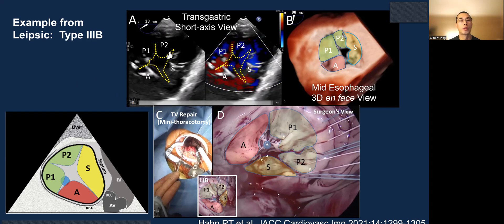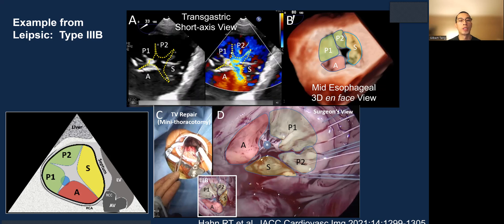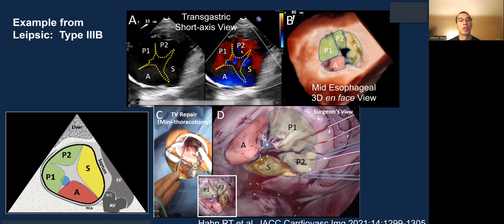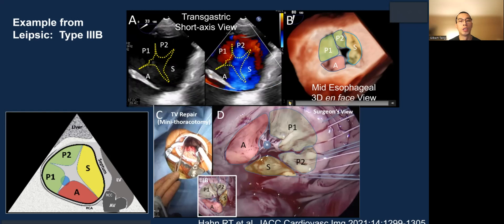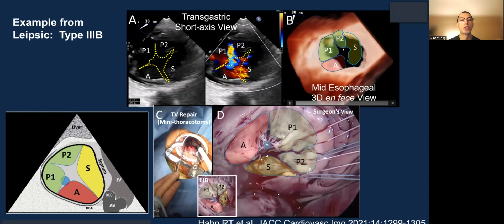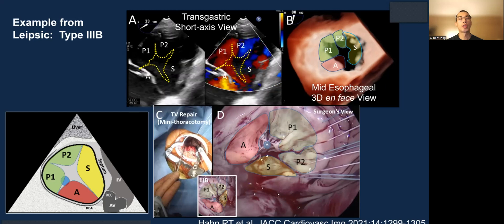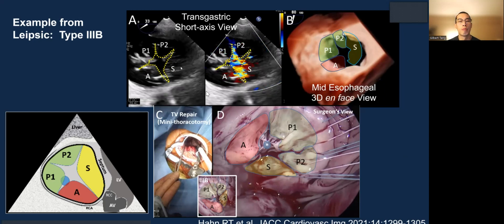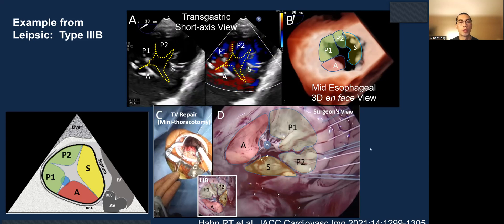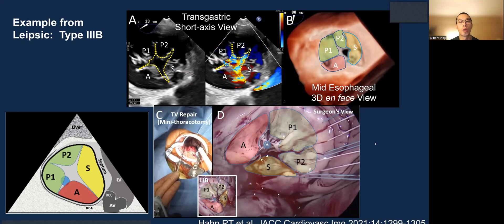Looking at the type 3B quadricuspid, you can clearly see there is a deep indentation separating P1 and P2, seen here on the 3D en-face view. This patient went to the operating room and you can see the morphology matches what you see in the echo on the surgeon's view.